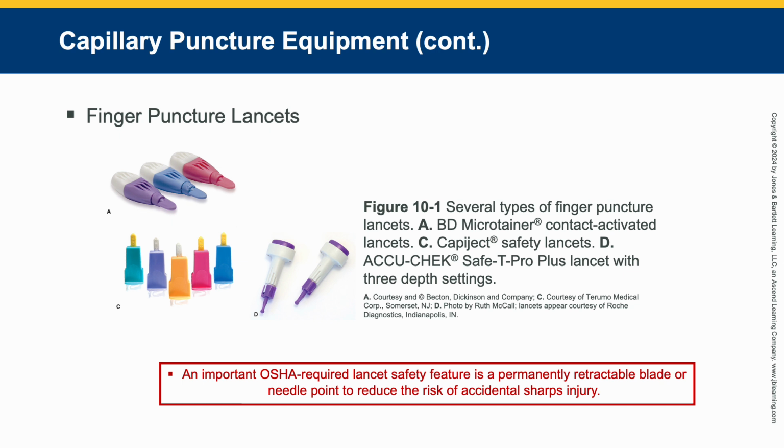But basically they are designed for one-time use only. So if you stick somebody with that lancet, you can't re-stick them with the same lancet. You're going to do it one time because they have these sterile blades or points on them. And even if your lancet misfires or does not actually puncture the skin, like if you don't do it correctly, you still can't use it again because that means it released that blade out. And so you're not going to be able to do that again.